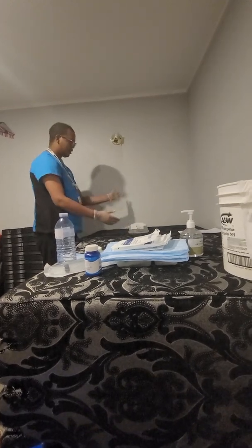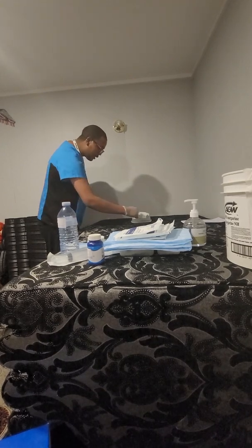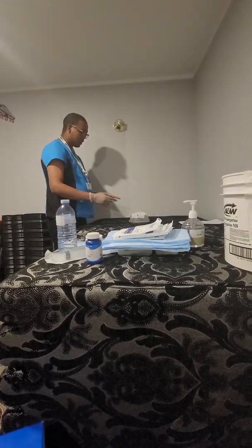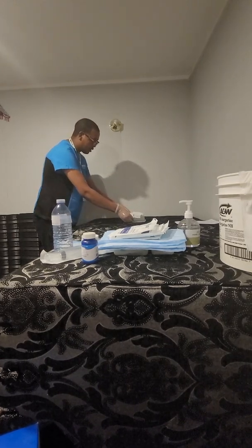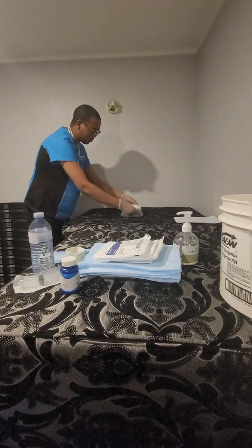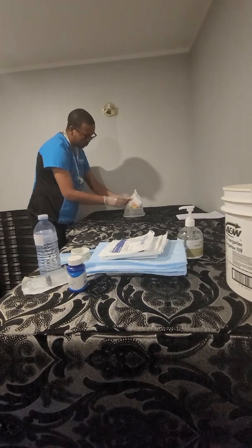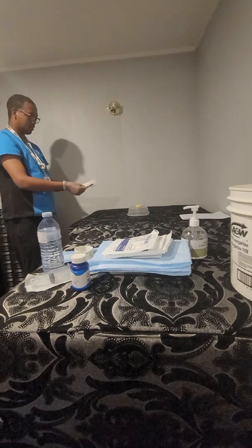Okay, so he's just lying this way, so I'm going to just remove it away from the sides. Date that was changed, it was 29/11/2020, which is yesterday at 7 a.m., which is good to change, and there is some shadowing over the top. And then I'm going to remove it parallel to the skin. Okay, I'm going to assess it.